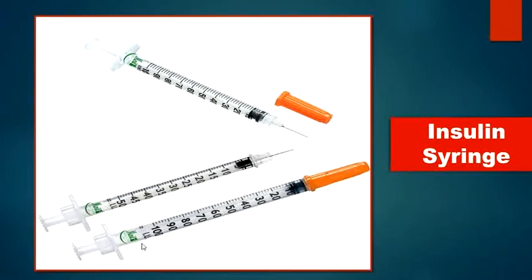What else do we have? Skin test. Skin test for what? For allergy to antibiotics, or hypersensitivity to antibiotics, especially penicillin, using a skin test with the insulin syringe. Other indications of use. Vaccination like MMR, very good. Given where? Intradermal, intramuscular? Subcutaneous, very good.